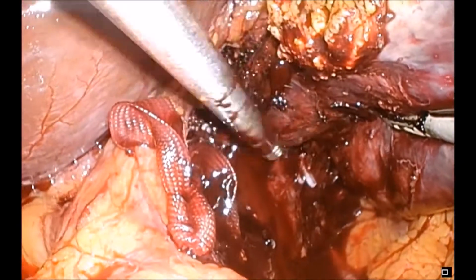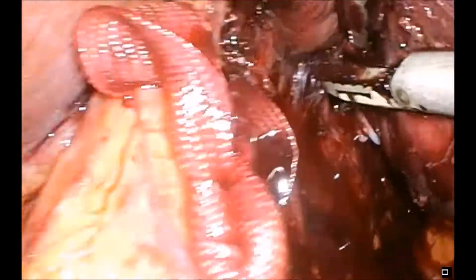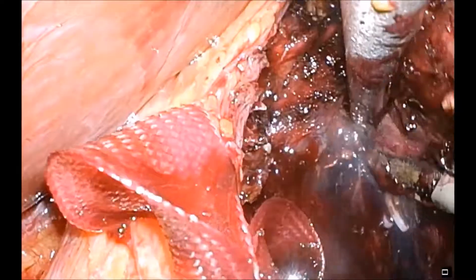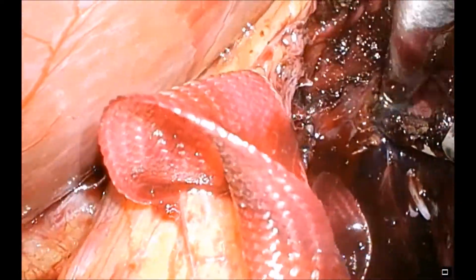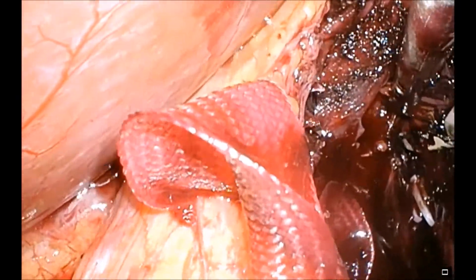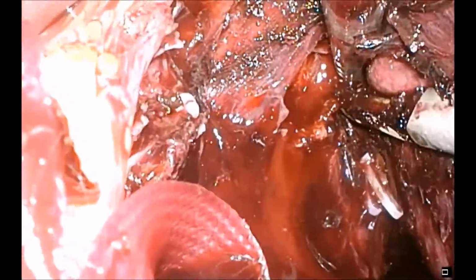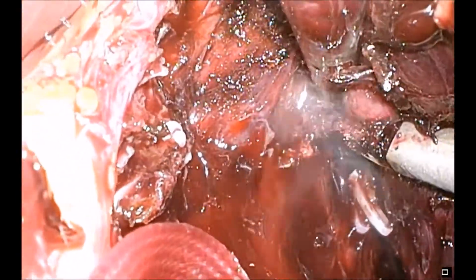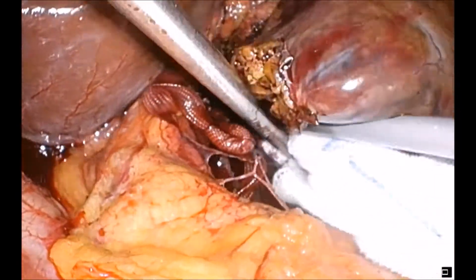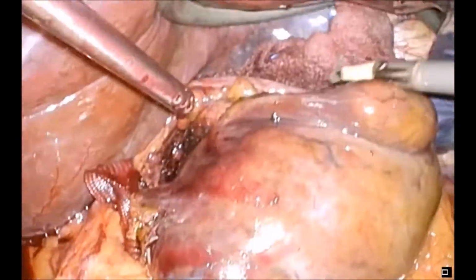One can see that there's just a fairly thin bridge of tissue now running in front of the inferior vena cava, and once we continue the mobilization of the cava off the back of that bridge, we'll be able to take that bridge with a stapling device. The shunt's now fallen away from where we're working, making life a little bit easier since dividing that bridge.